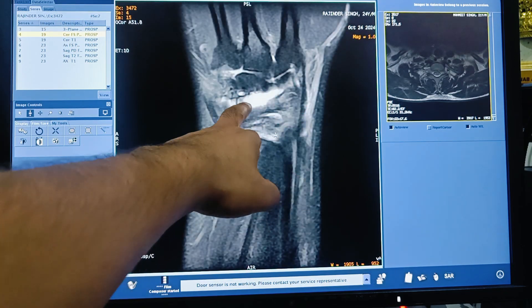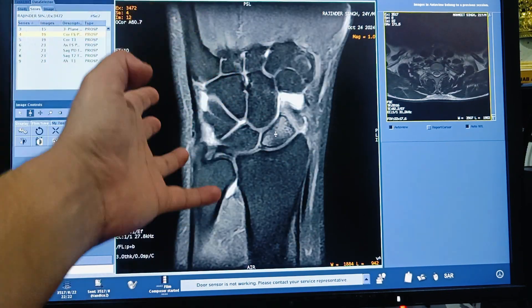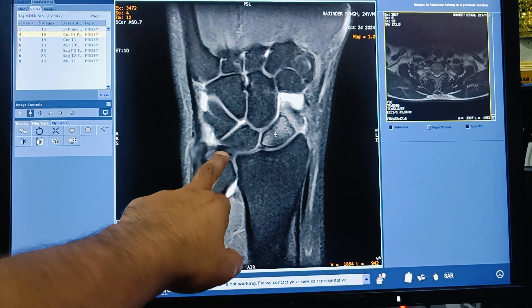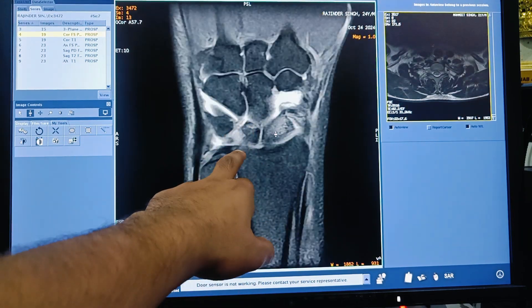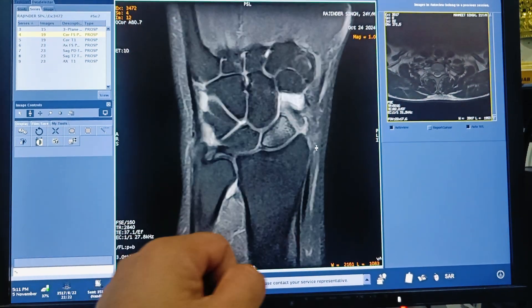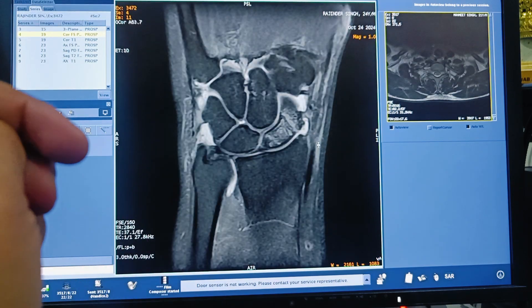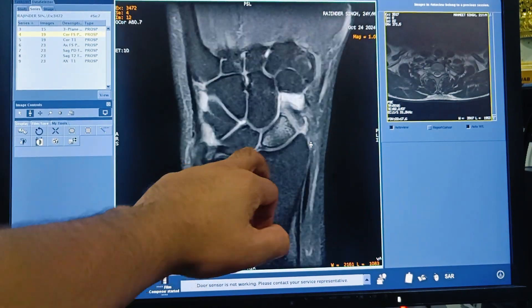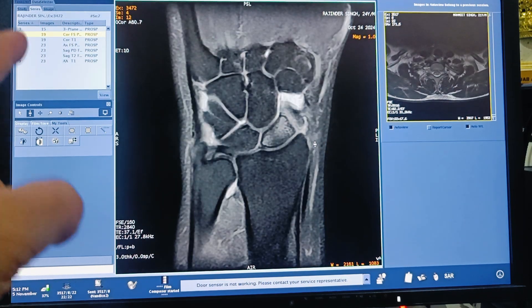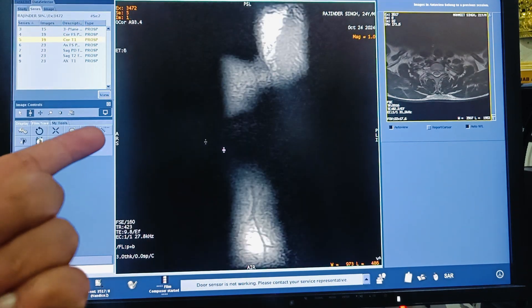In PD fat suppression, other signals such as fluid, fractures, and other pathological findings appear hyperintense. This is a coronal PD fat suppression sequence — the plane is coronal and the sequence name is proton density fat suppression. Here you can see the scaphoid bone with a hyperintense signal in the mid-scaphoid, which represents a scaphoid fracture.